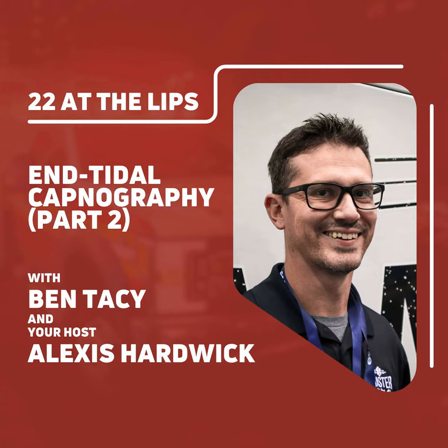All right, so the AHA's gold standard is an End-Tidal minimum of 10 to ensure adequate CPR is being performed. That's super low, but it lets you know that there is a huge VQ mismatch. Perfusion is bad, so nothing's getting to the alveoli. But now they've upped it: ideally 15 to 20 is good, with your minimum of 10. So now we see that 15-ish, like, okay, we're doing good CPR.